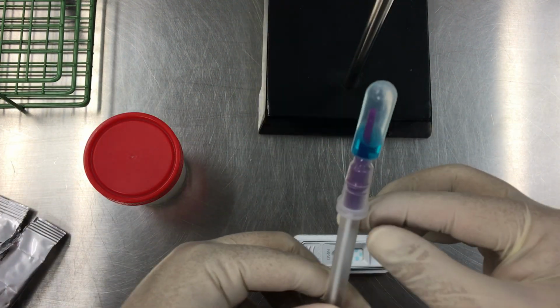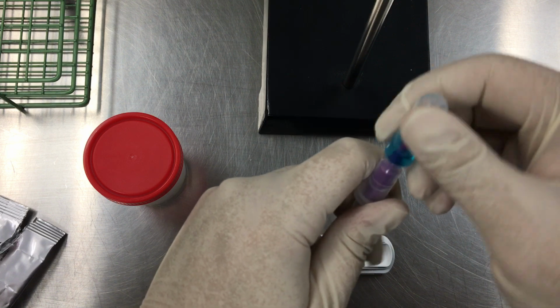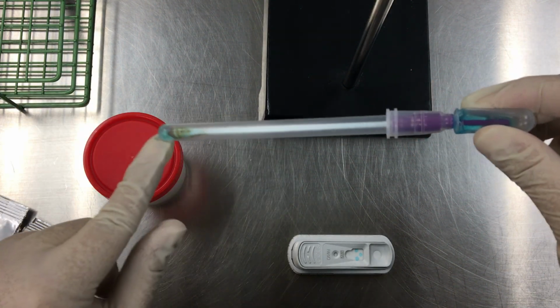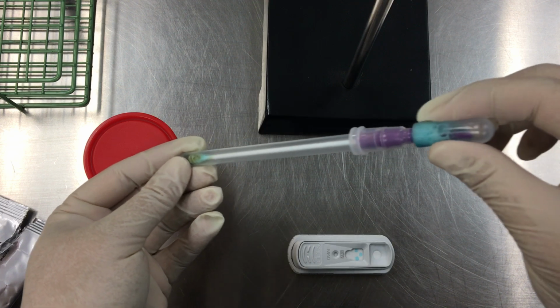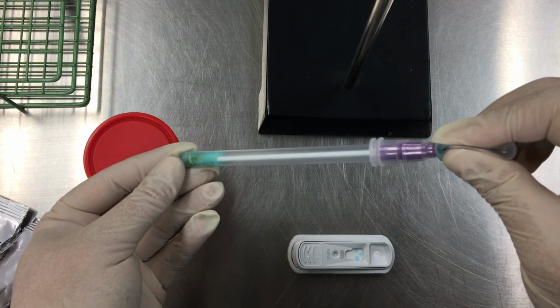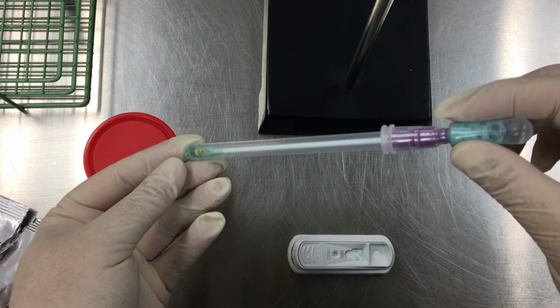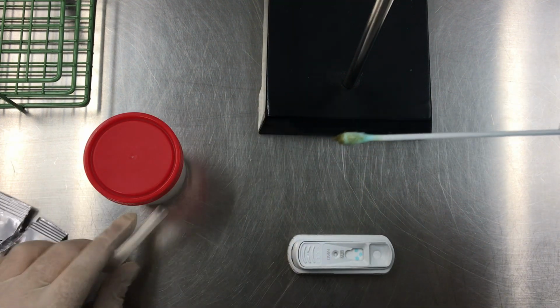Okay, now in order to release the conjugate, we're going to have to break the seal. So I'm going to snap it away from me and then towards me. And then I'm going to squeeze this bulb, and you're going to see it come down into the tip. And I like to mix the sample really well with the conjugate, so I'm going to squeeze it a couple times. Okay. Once it's been mixed, you can remove the sheath again.